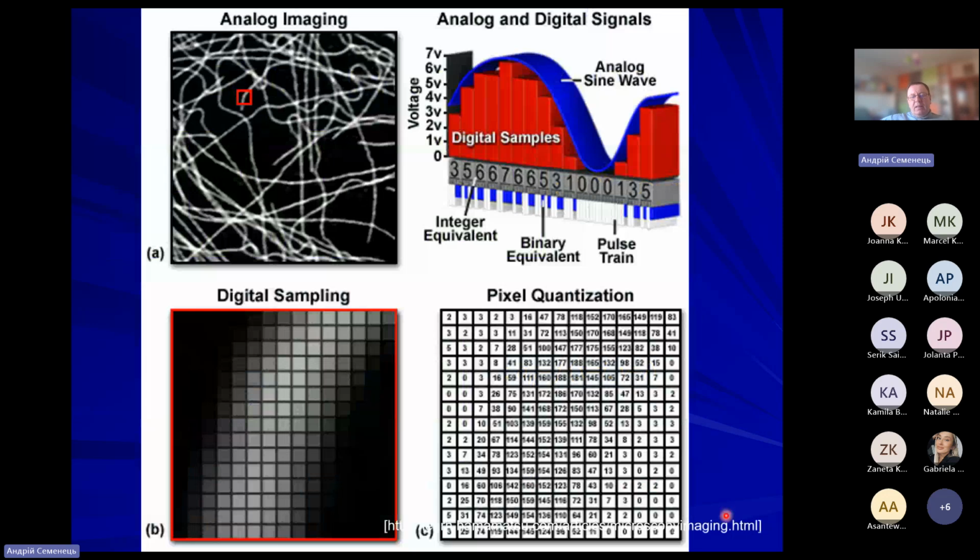And here is again, to finalize and put this all together, how it actually looks practically. First of all, we have the analog image at top left, which is the energy which has been illuminated over sensor arrays.